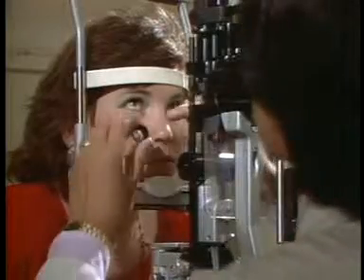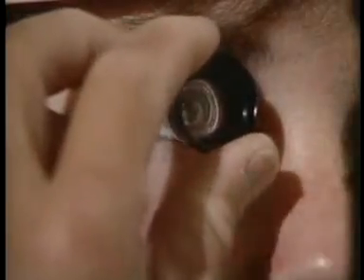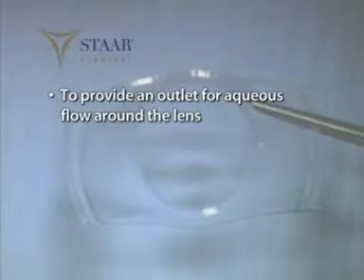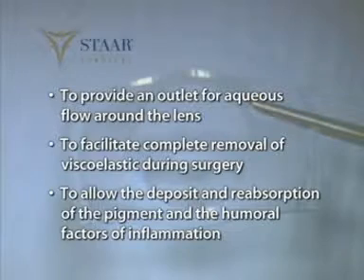One to 2 weeks before implantation, it is necessary to perform peripheral laser iridotomies, or PIs. PIs are necessary to provide an outlet for aqueous flow around the lens and to facilitate complete removal of viscoelastic during surgery. They are recommended 2 weeks prior to surgery to allow the deposit and reabsorption of the pigment and the humoral factors of inflammation.